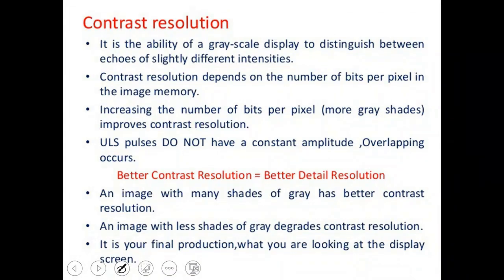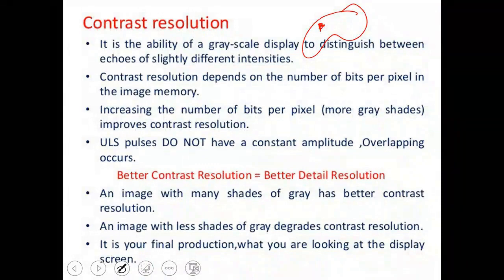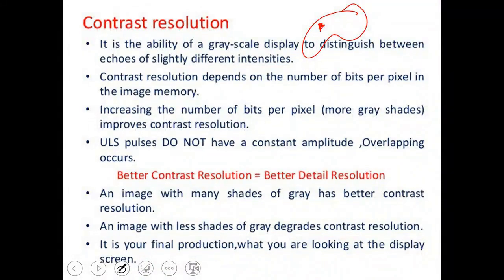If you remember, for example, I was talking about having lesions in the liver, right? If I have a stone in the kidney, is this stone high density or low density? High density, and the kidney has a significant difference in density between these two objects. In this case, I say I want to measure the image quality.